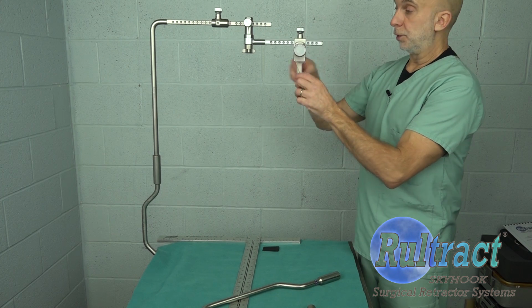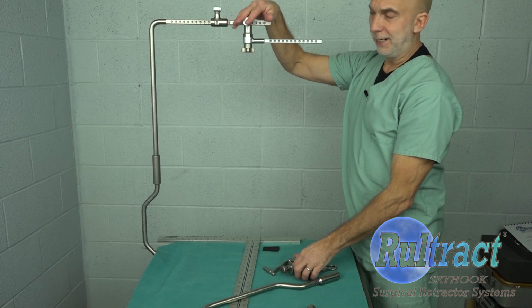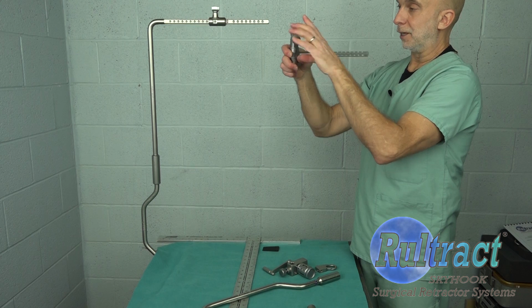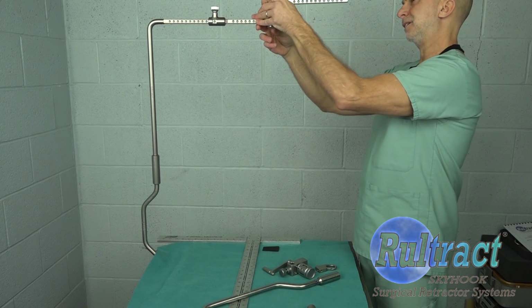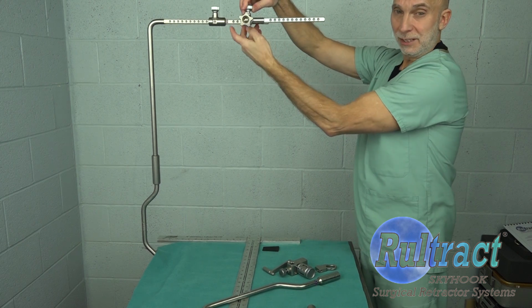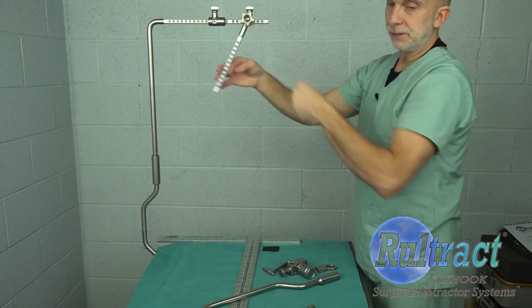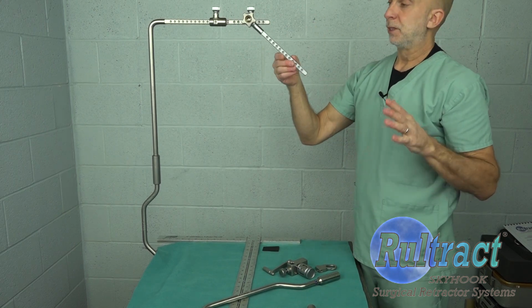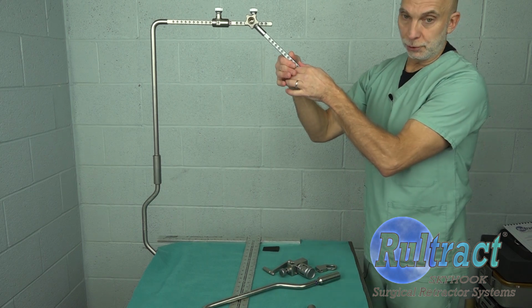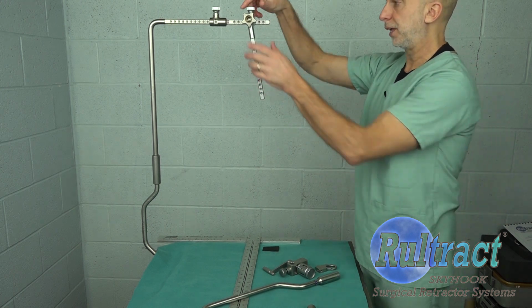One other thing to note is I have seen surgeons that will take the rotating extender bar, put the tightening knob here on the top, make sure that it's lined up and into a detent, and then they will have 360 degrees of rotation this way. That will allow them, if the patient is even smaller, to get closer to the Thoratrak and then get the proper angle. So there are a couple of different ways to approach that.